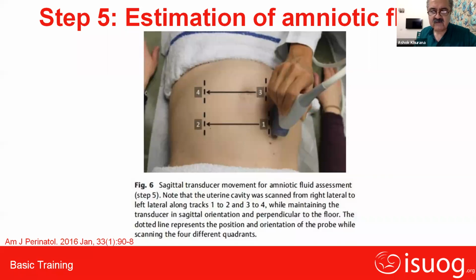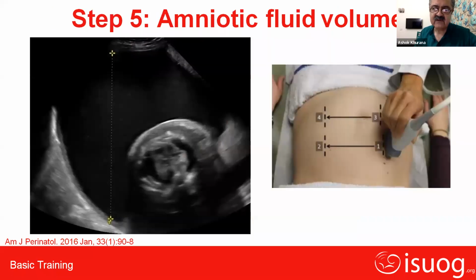When you become more advanced, you will be told several times that we assess the amniotic fluid only subjectively and say whether it is normal or not normal. Yes, there is no doubt that as you become an expert, you will say the amniotic fluid is normal. But for the sake of serial comparison wherever it is required, and to make sure that each one of us speaks the same language, which is the most important thing in biology, it is wise to quantify and to put it in the body of the report as well as in the conclusions of your report. So it is a very important part of the examination, the estimation of amniotic fluid volume.